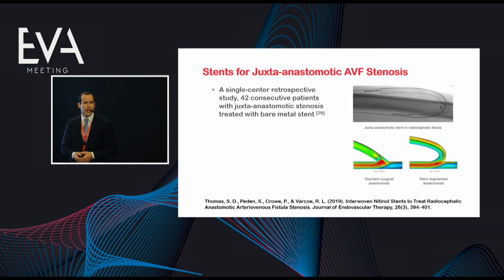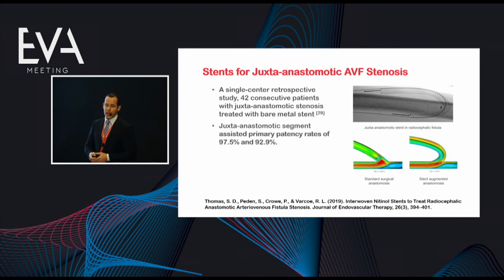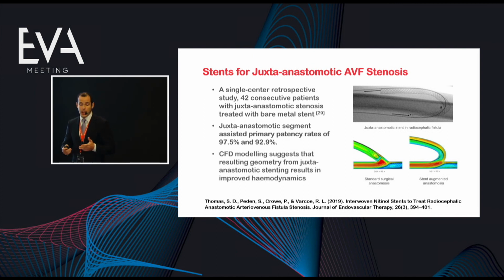even better with the Supera stent, as shown to us by Dr. Thomas, 42 patients, rescue of the fistula, and you can see the primary patency rates at 2 years are very high, 98 and 93%. Of course, even the stent just changes the geometry and gives you an even better flow, as demonstrated by this analysis.